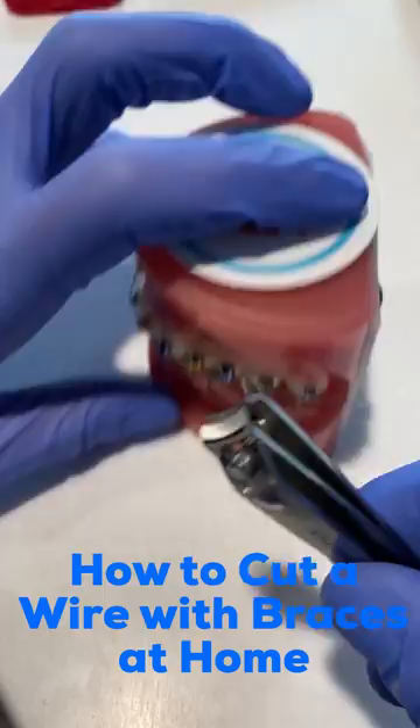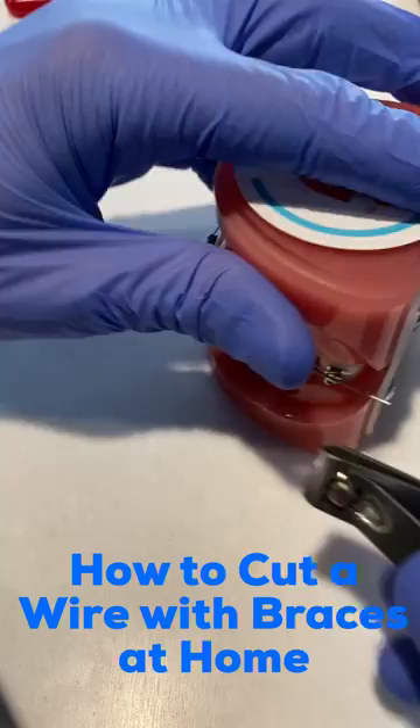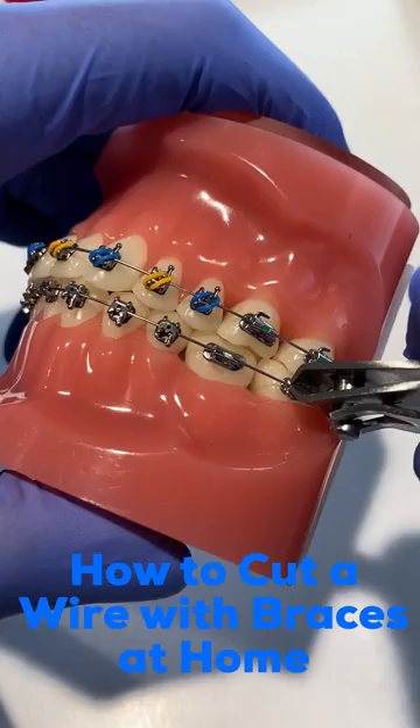Then what you're going to want to do is take that nail clipper and cut the wire as close as you can to the bracket where the wire is sticking out, and cut that section.